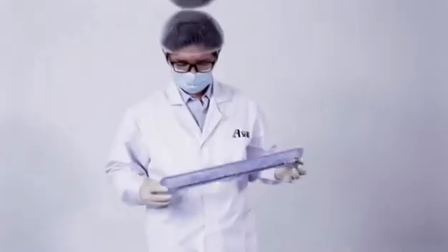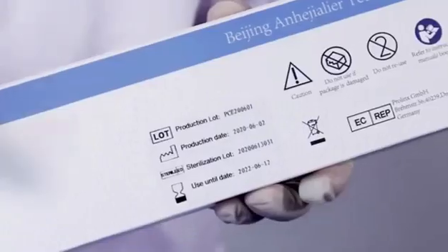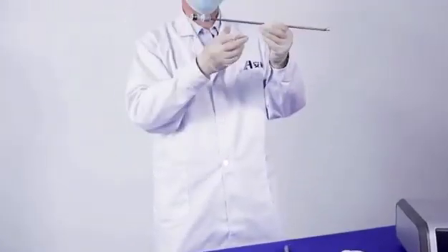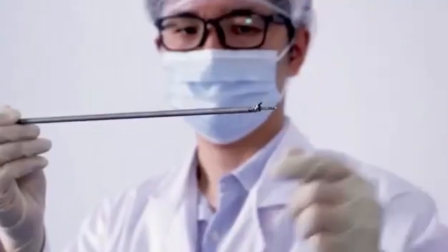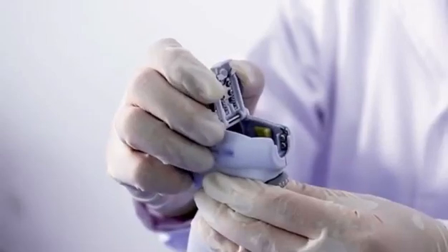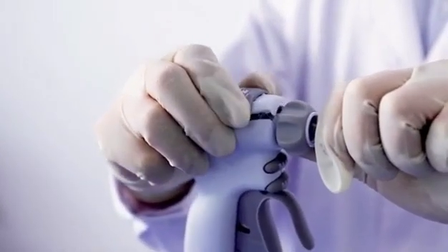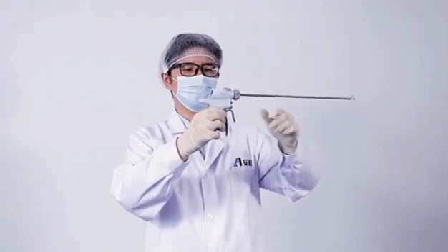Assembly. Inspect the package and expiration date before opening. Using aseptic technique, remove the scalpel from the package. Push the rear end of the scalpel until the maximal opening of the jaw. Pull and unlatch the hatch. Insert the rear end of the scalpel into the opening of the handle. Close and latch the hatch. Slightly move the hatch to ensure it is locked safely.